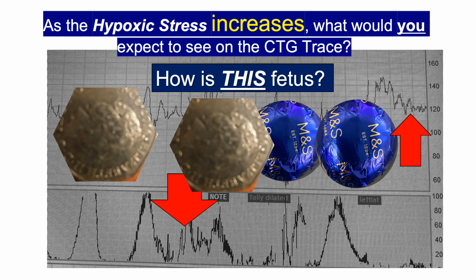Please also remember, uterine hyperstimulation is not defined as more than 5 contractions in 10 minutes, because uterine contractions have 3 properties: duration, strength, and frequency. Sometimes you might have only 2 contractions, but they are lasting longer and they are stronger. And if you find changes on the CTG, that is uterine hyperstimulation. So when you use prostaglandins or oxytocin, please remember the definition of uterine hyperstimulation is any increase in uterine activity associated.